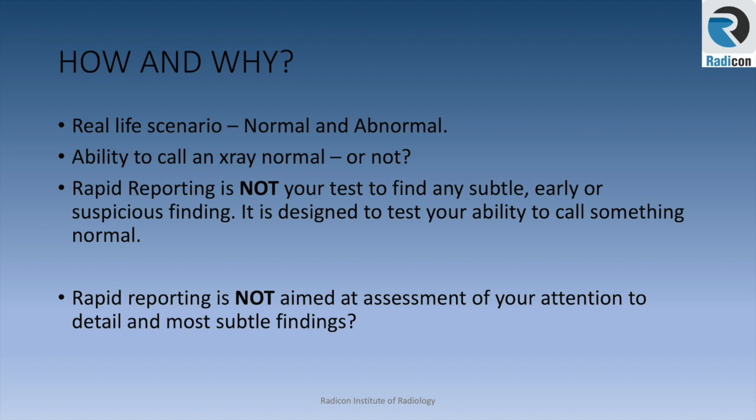Rapid reporting is like a real life scenario. Some films are normal, others are abnormal. If you are going to give a weak report on every single image asking for clinical correlation, CT, and MRI, then you will have a big problem passing the rapid reporting part of the exam. It is in fact designed to check if you can be a good and confident consultant and safely say, look, this is a normal film.